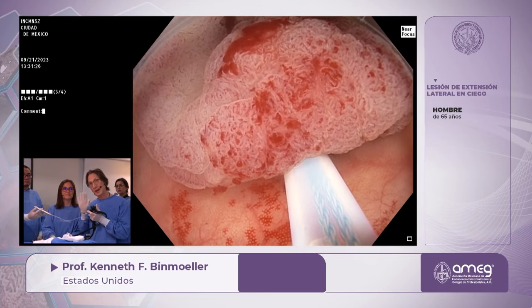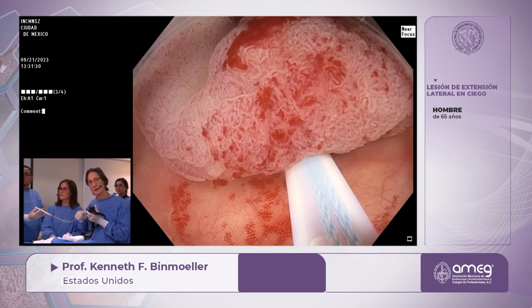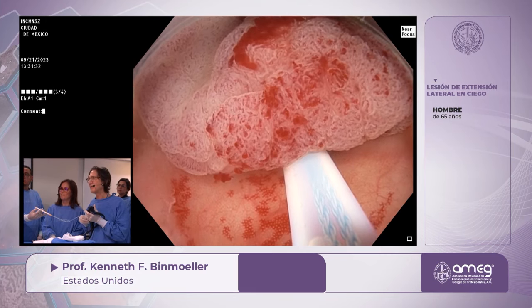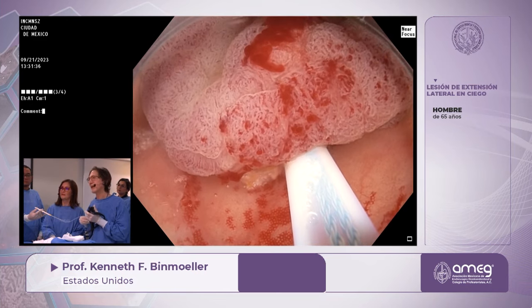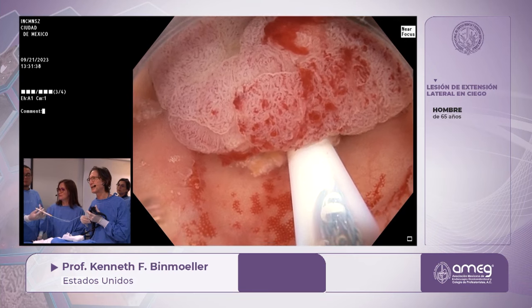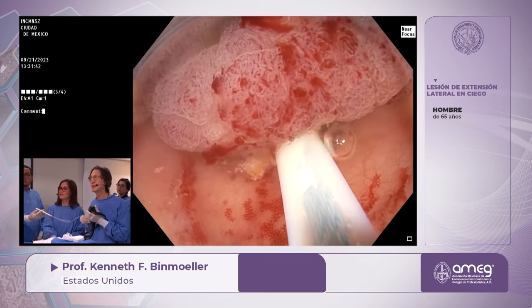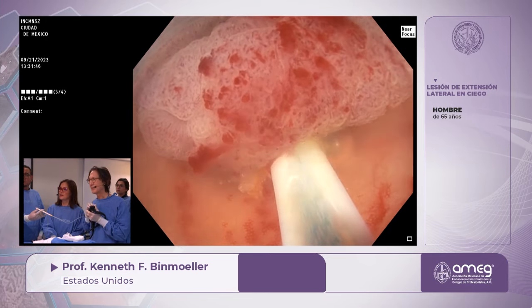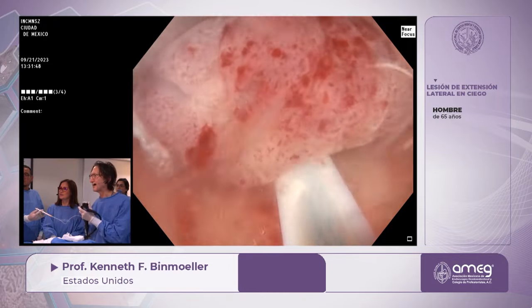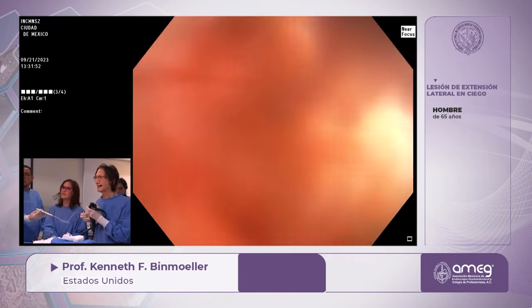And I'm just going to step on the pedal. He's just going to hold it closed a little bit. And I'm just giving current now, yeah? And very, very, see, it's bubbling there? You see that? That's a good sign. Now start to close slowly. Despacito. Slowly close. Close, close, close. The bubbles are coming. We have the heat sink effect. Keep going. Despacio. Keep going. Giving some water. Agua. Keep going. Now, okay. Now it's done.